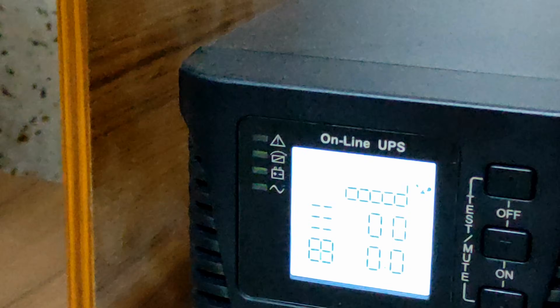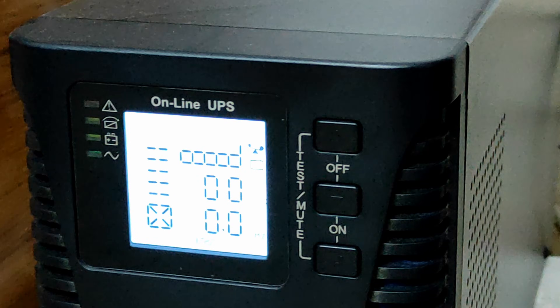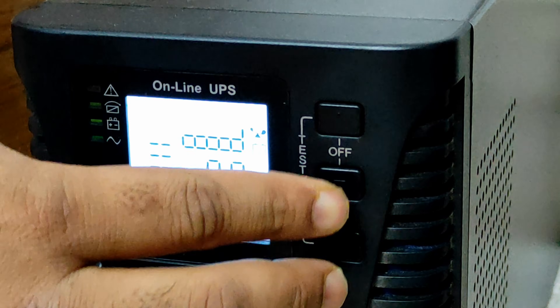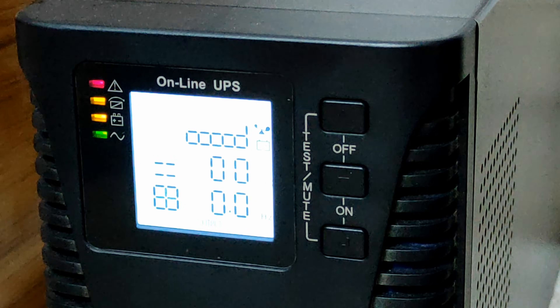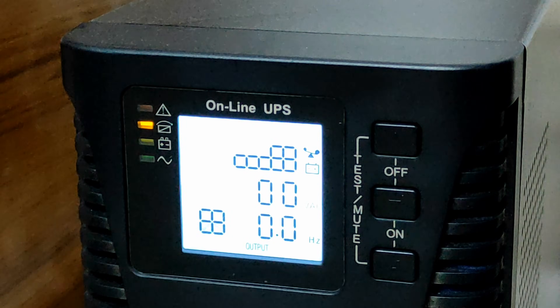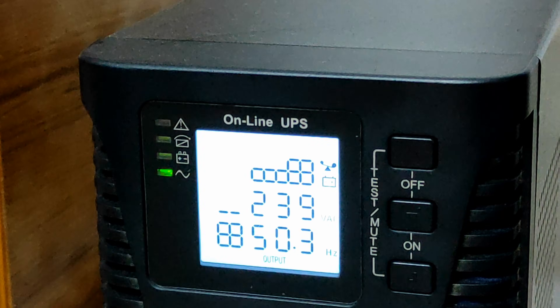Then you have to press on these two buttons — the lower one and the middle one. Just press and hold for one second. Then you will hear a sound, which means your stabilizer is on.